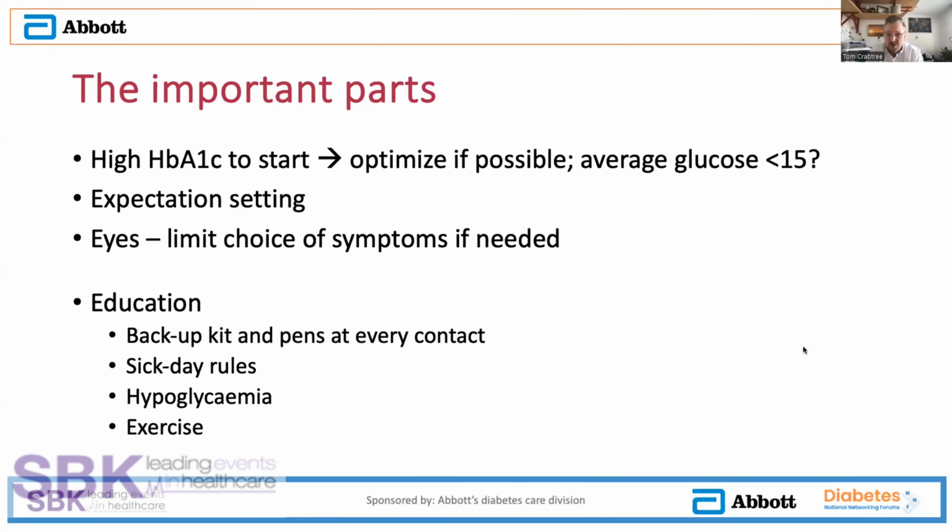But if someone's got a busy family life, busy work life, they look and they're like, oh, it's 17, it's been 17 for 3 hours, but that's normal for me. I'll just crack on still. There's a risk there that they're going to go into DKA. So that's kind of the purpose for setting this target of 15.